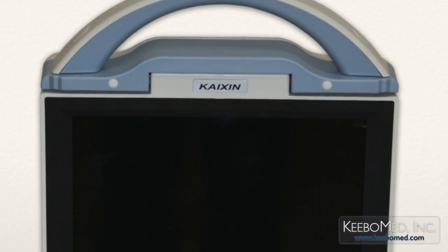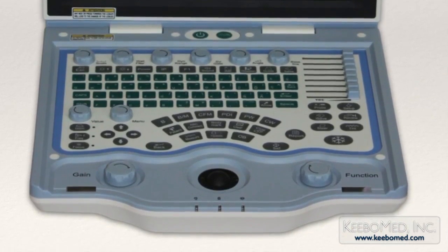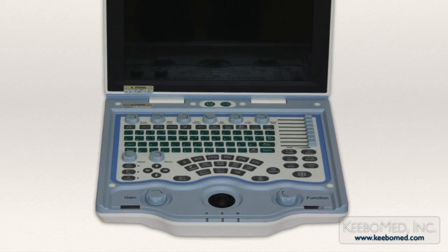The DCU-12 is a fully digital, colored Doppler ultrasound that has many unique features and functions. It is easy to use, has proven to be very reliable, and is the most affordable colored Doppler ultrasound on the market today.